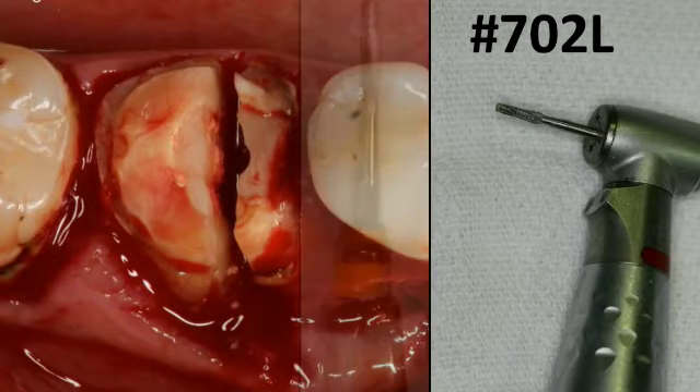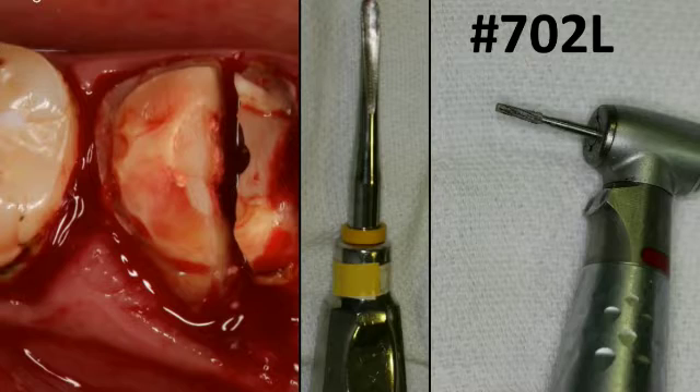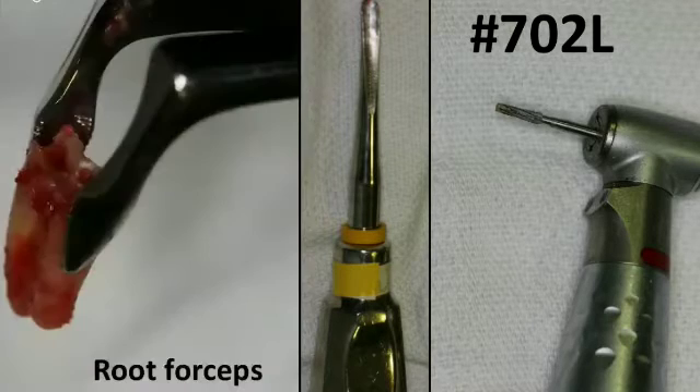Next, I'll use a medium-sized elevator just to mobilize the root — I don't need to extract them. These are not very curved roots, so I'm just going to mobilize them. I'll place my elevator between the adjacent teeth and the root, and sometimes in between the two-sectioned parts. Just mobilize them, and when they're adequately mobile, you can use your root forceps and remove each root separately.